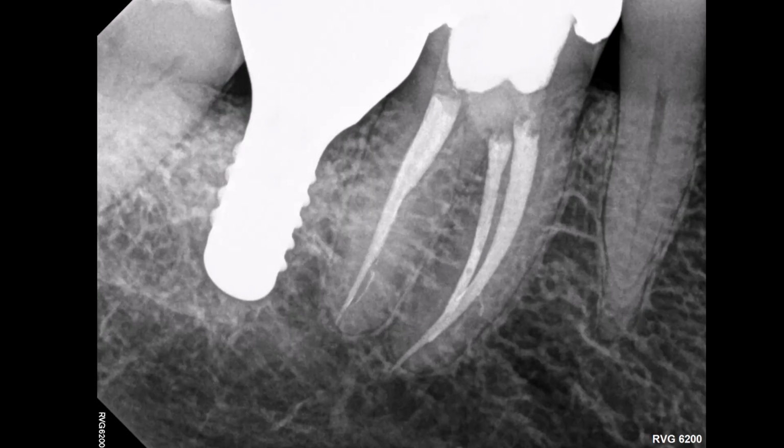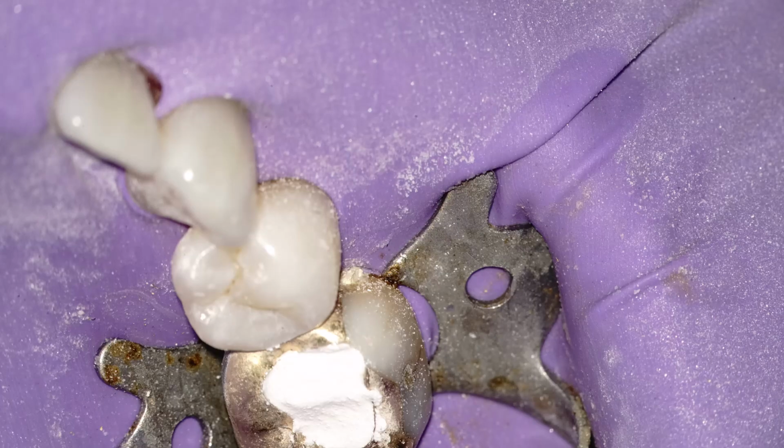You can see a couple of accessory canals and a distal loop. The Cavit temporary filling was compressed to push the Biodentine completely into the resorption prep without creating voids. I intentionally overbulked the Biodentine so that it squirts out any communicating area. You can see some excess Biodentine at the MB line angle on this photo.